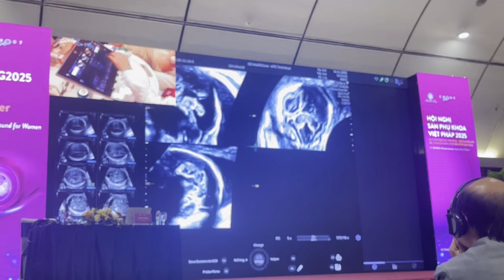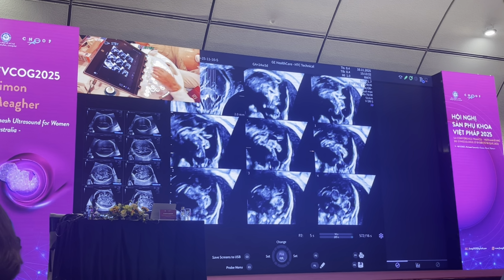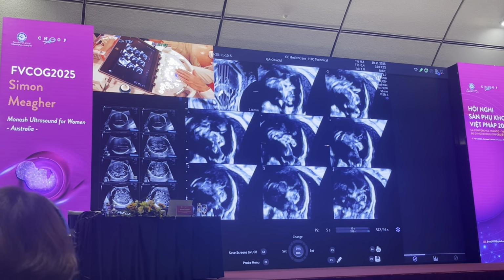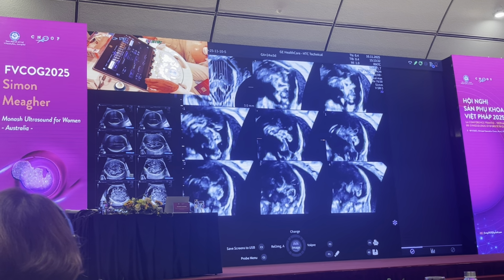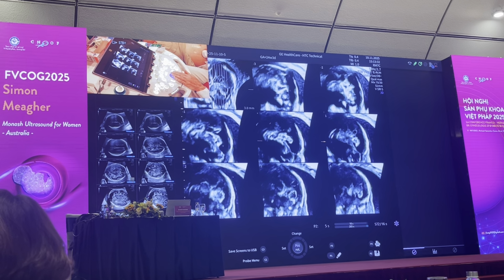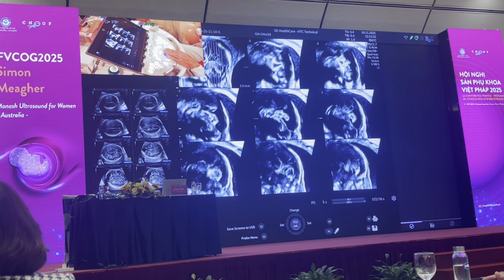When I'm looking at this, I can then look from the left cerebral hemisphere to the right cerebral hemisphere. So we focus up here on this plane, I need to do a Z-axis rotation just to make sure that I'm actually getting a correct view through the full cerebellum from left to right. I can then also increase the distance, so I'm examining from the right cerebral hemisphere to the left cerebral hemisphere. And you can see the cerebellum hemisphere here, to the vermis in the midline here, to the brainstem here, and then go across to the cerebellum hemisphere on the opposite side.